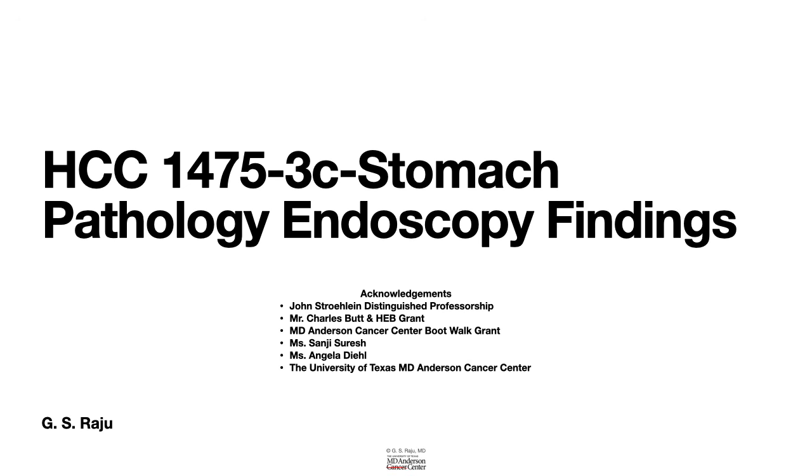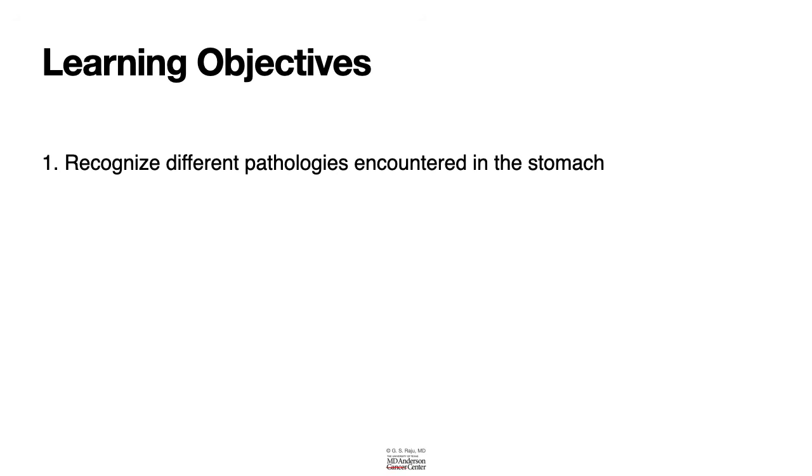Let us learn about identifying different pathologies that we encounter in the stomach. As an endoscopy technician or as an endoscopy nurse, it is important to recognize different pathologies that we see during EGD.